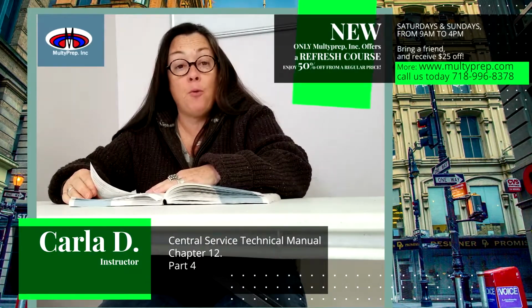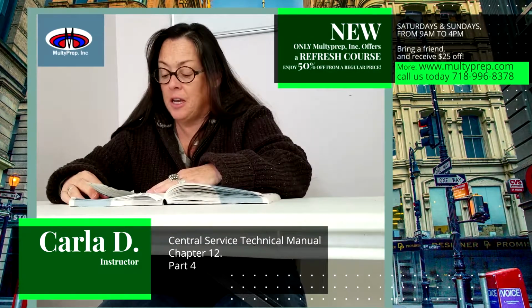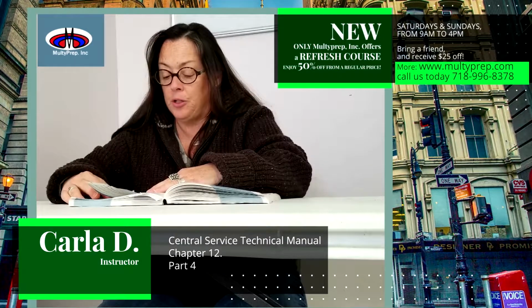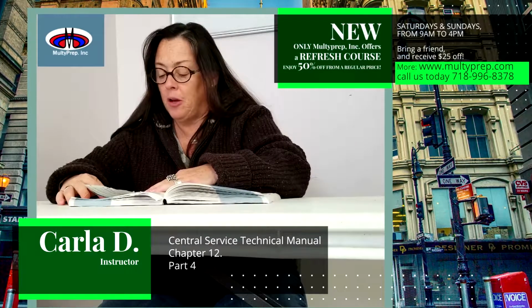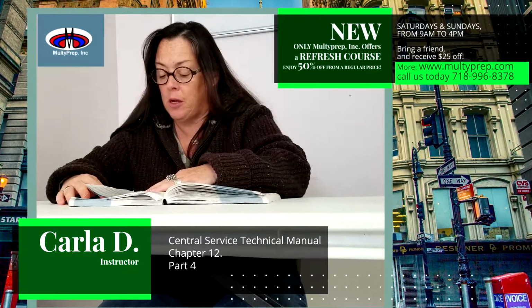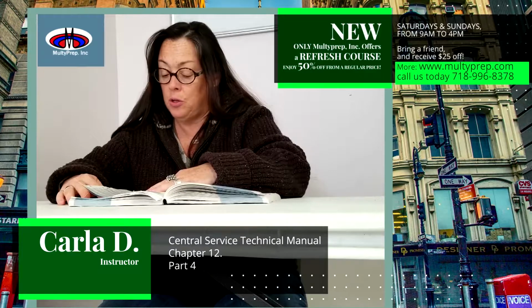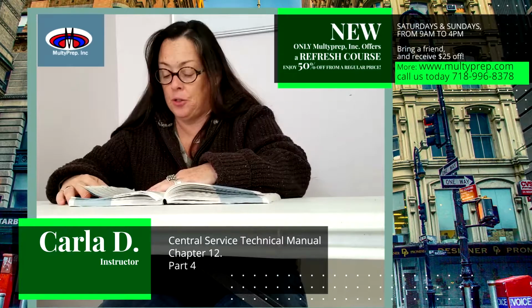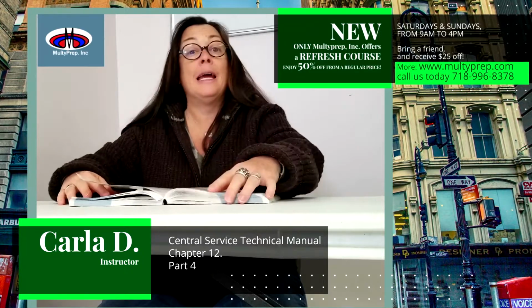Chapter 12, Part 4. In addition to selecting the appropriate packaging materials, CS technicians must understand how to use sterilization packaging appropriately to achieve the desired results: sterilant penetration, barrier effectiveness, and aseptic opening. Packaging systems used in healthcare facility-based sterilization are generally classified into reusable packaging and disposable single-use packaging materials. Each packaging system has advantages and limitations. The following sections provide some basic information about common packaging systems and their applications.